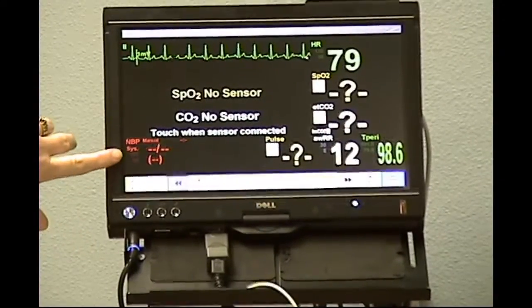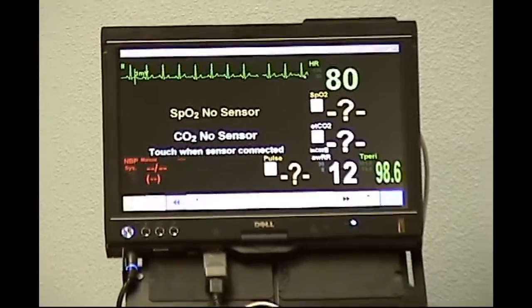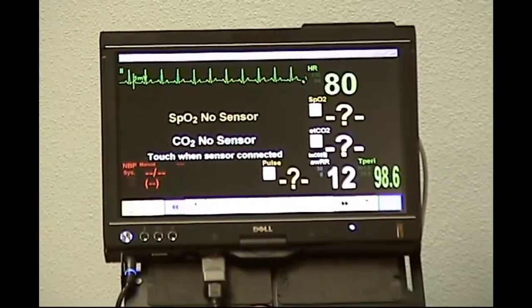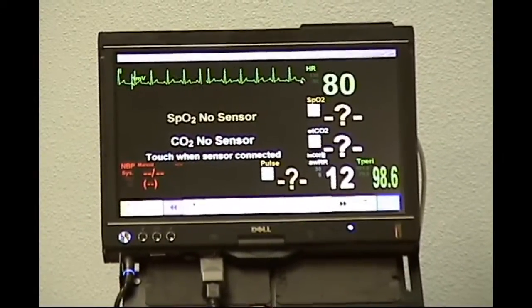Because the simulators operate wirelessly, we require that all cell phones be turned off as they interfere with operation and could negatively affect your ability to interact with the simulator. Remember to always conduct yourself in a professional manner, just as you would in a live patient's room. Remember also that you are always on audio and video, so everything you say and do is recorded here.